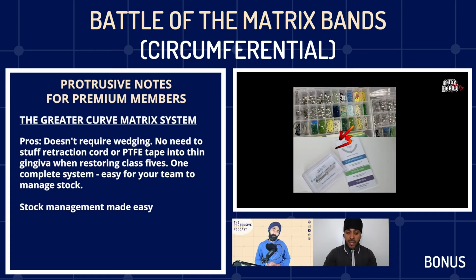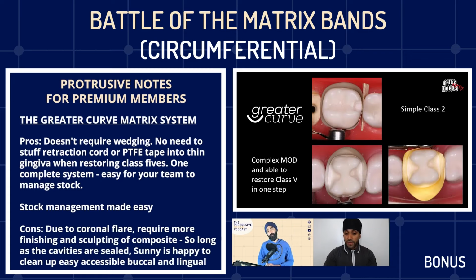And when it comes to the downsides, because again, everything's got downsides, due to the coronal flare, which is fantastic for reaching and for setting contact areas, it also means that we require more finishing and sculpting of the composite along the buccal, lingual, and palatal. But for me, that's not much of a big deal, right? So long as the bases of my cavities are nice and sealed and they're overhang and void free, I'm more than happy to adjust the buccal and lingual aspects after. It's a small price to pay.